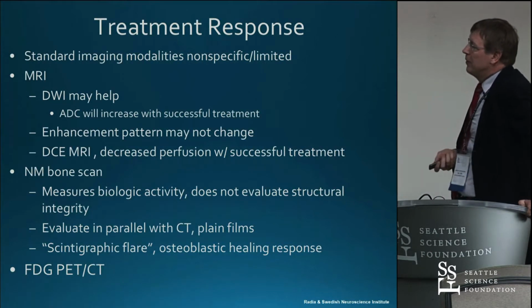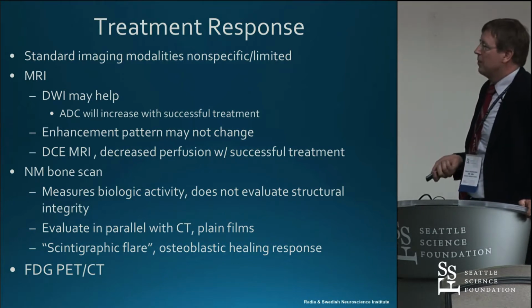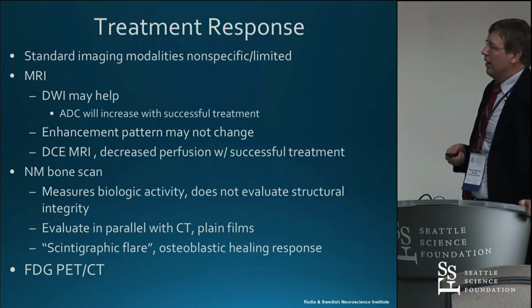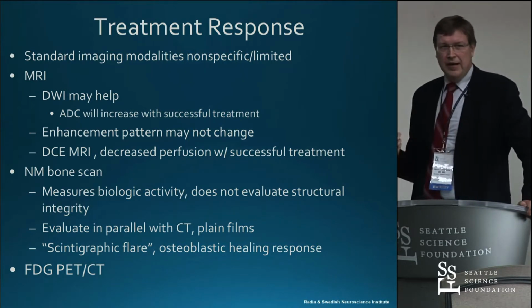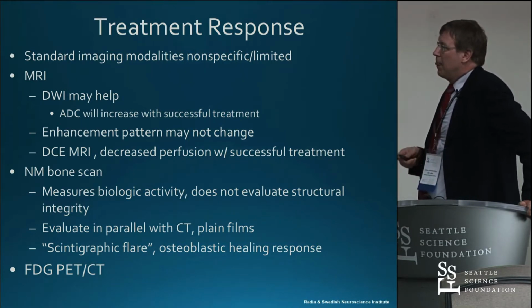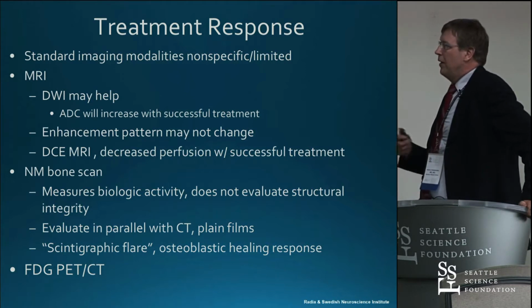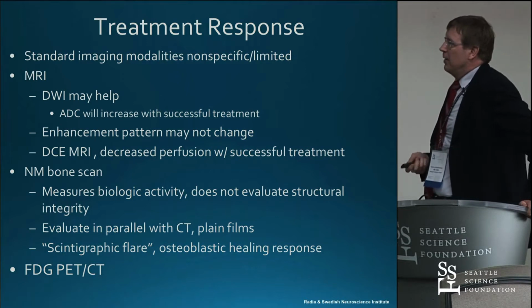Very briefly on treatment response, it's certainly a topic of many individual talks, but one thing is the standard imaging modalities are somewhat non-specific and limited. MRI is commonly used. One thing about MRI is that the enhancement may not change. Certainly increased enhancement means increased tumor volume, but if it doesn't decrease, it doesn't mean the tumor is not responding.